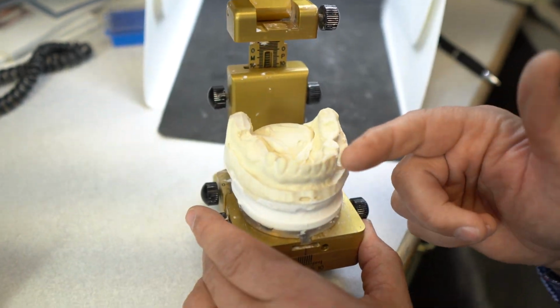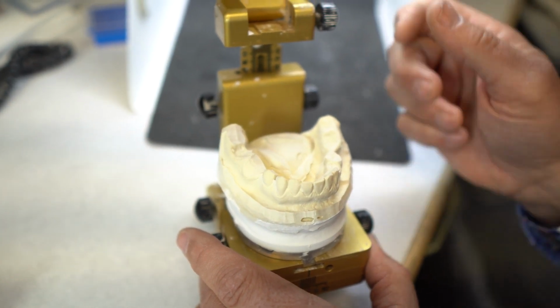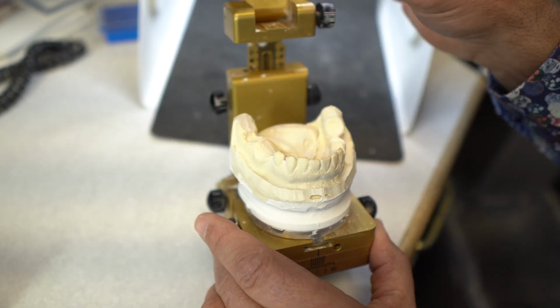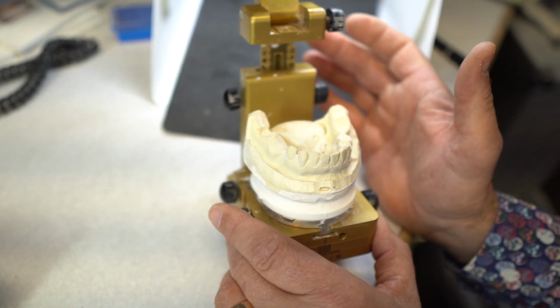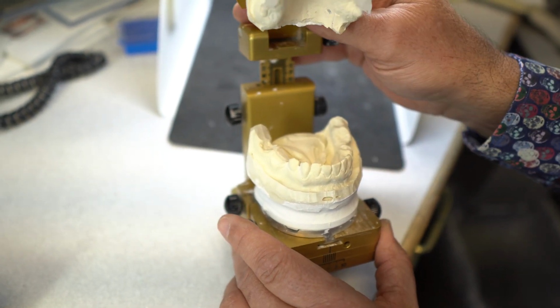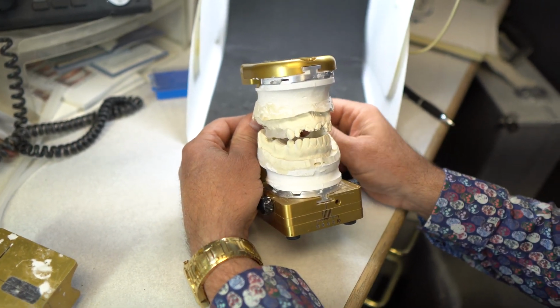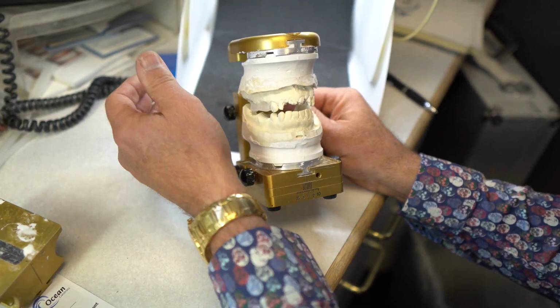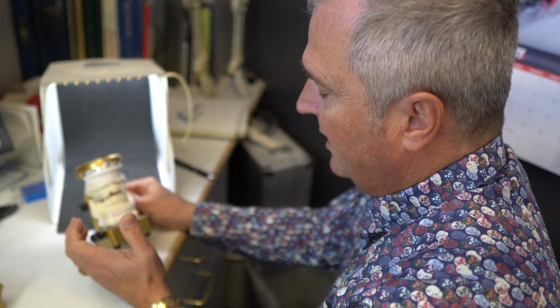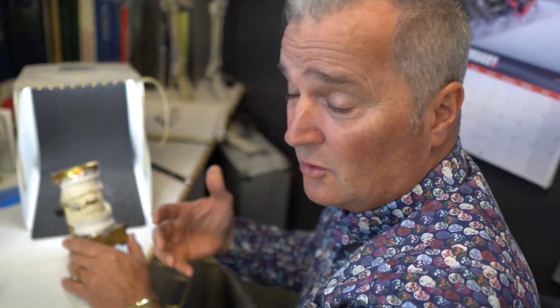Same down here. This could have been a crown and bridge restorative case with implants. For whatever reason, maybe because of financial reasons, the patient could only do an immediate denture, and that's fine. But we still work with the same principles. Level the plane of occlusion and find a healthy VDO that complements the jaw joint, airway, and the muscles are always happier. The patient will look more youthful when you open this up, and they'll breathe better, feel better, and ultimately the restorative will last longer.